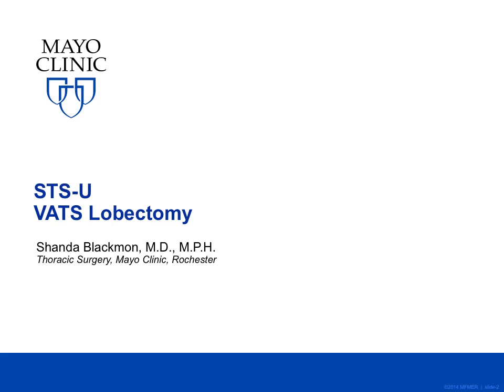Feel free to begin your transition by dissecting from the front to the back in open cases, and then slowly, gradually decreasing the size of your incisions and making your incision anterior rather than posterior. We wish you luck in your adventure to begin video-assisted thoracoscopic lobectomy as you aim to improve the care of your patients.